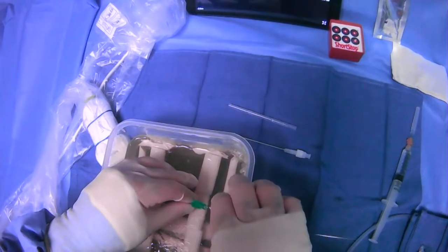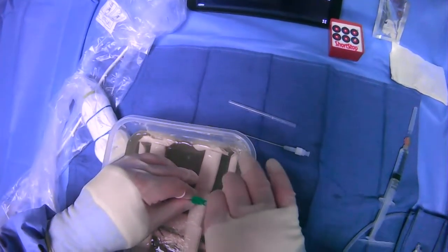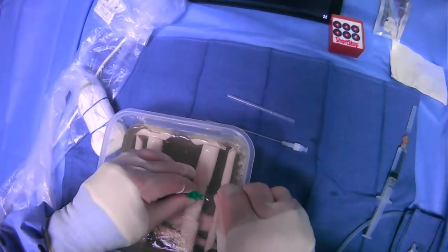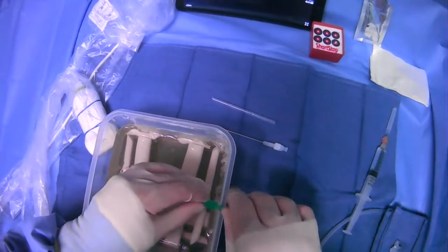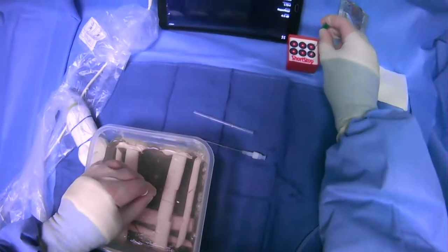At this point, we can grab the needle as we're pushing the wire in, and once we push it in a fair amount of distance, we have to make sure that it's going smoothly. But once we get in enough, we can walk the needle off like so. There we go. We can bury our sharp.